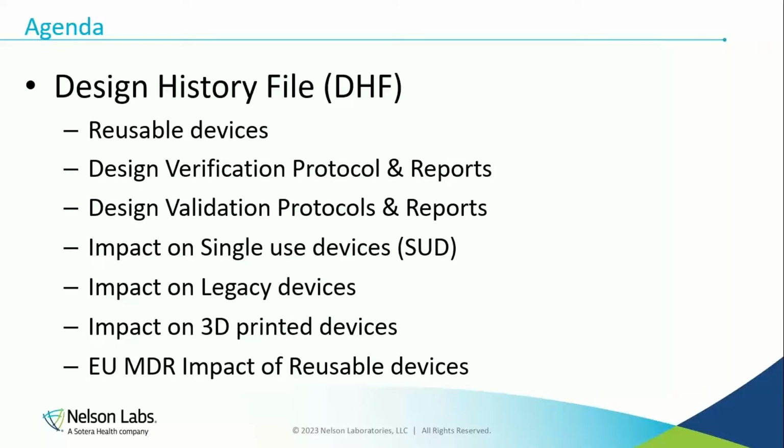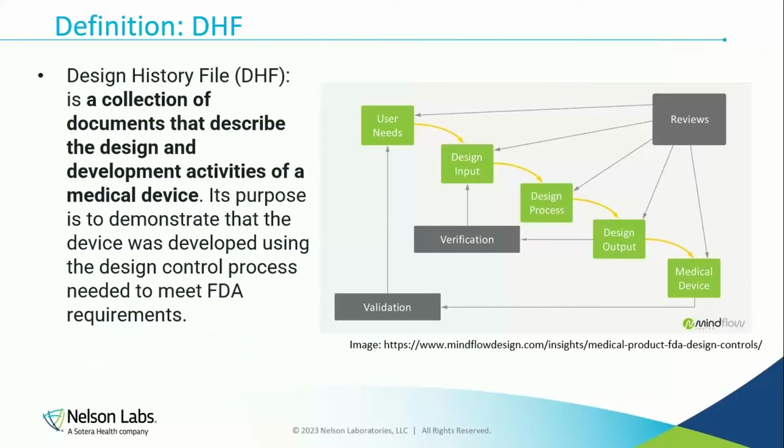Also, the impact of EU MDR. What impact does it have for reusables? There is a huge section in there just on reusables, and where does that take you, and what do you need to use for validations?